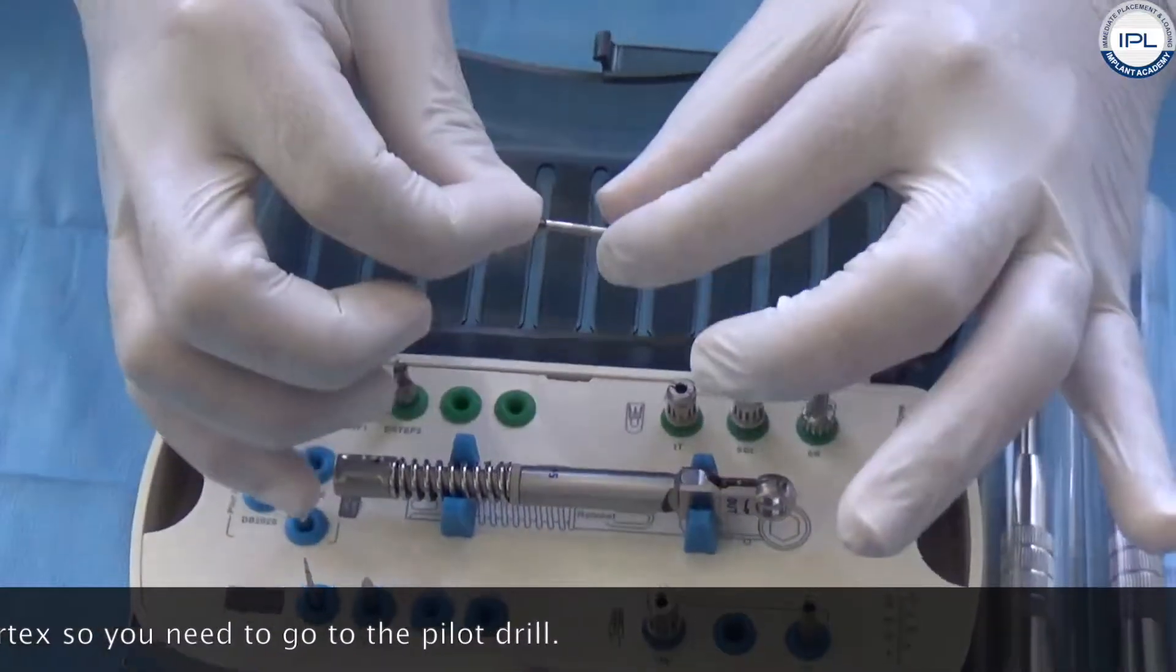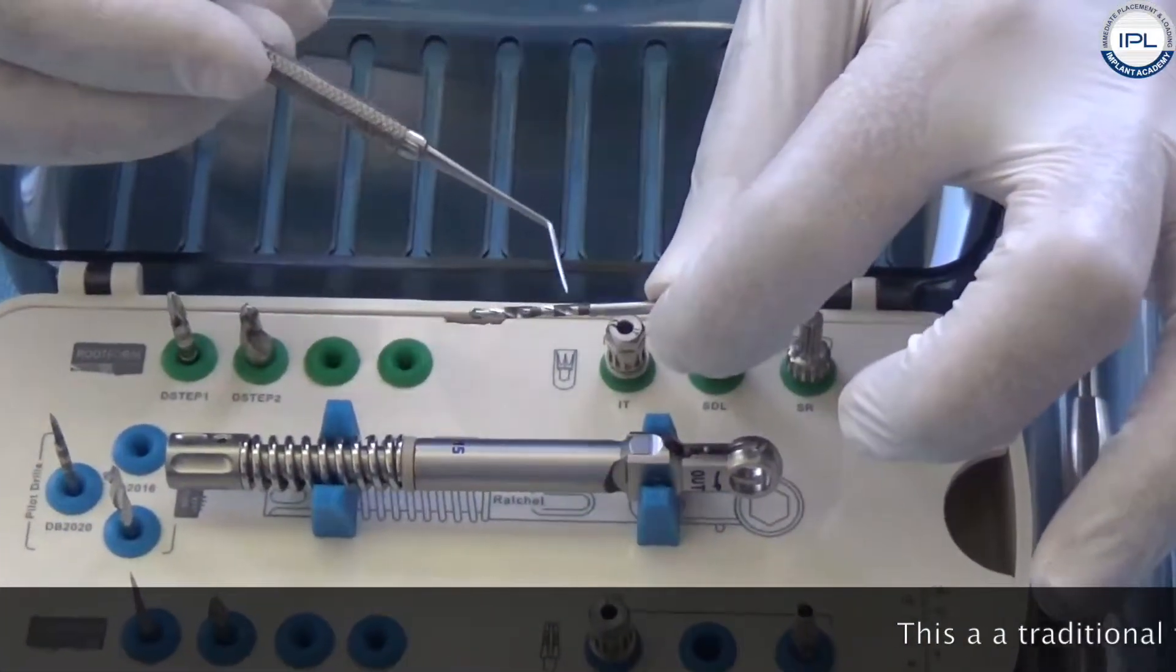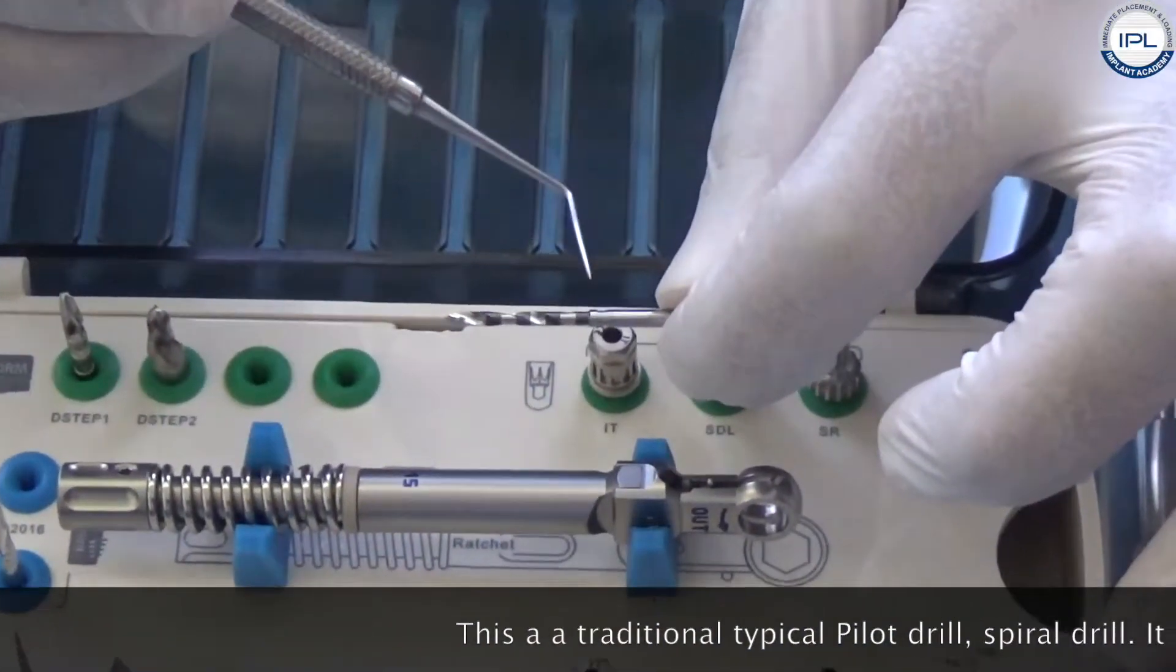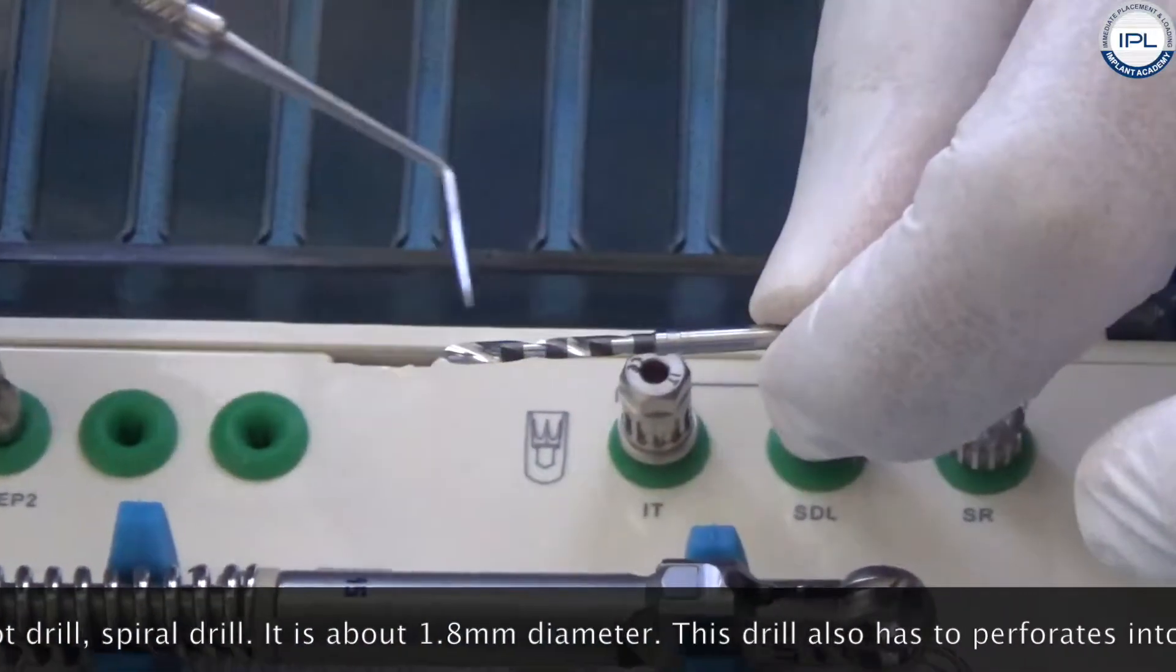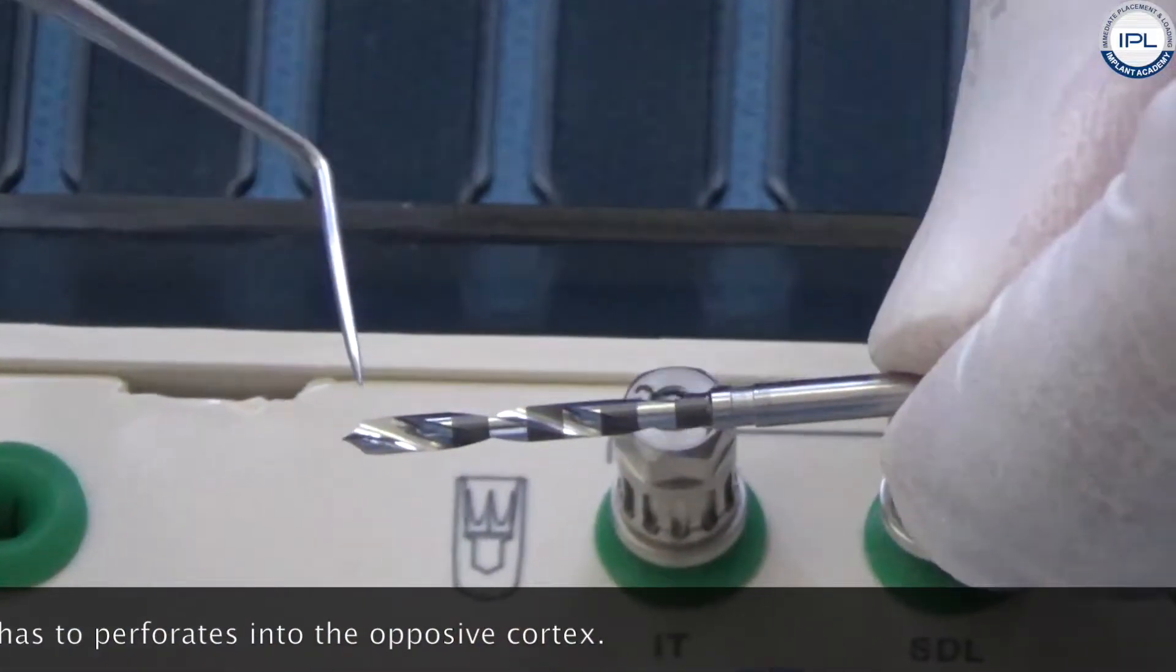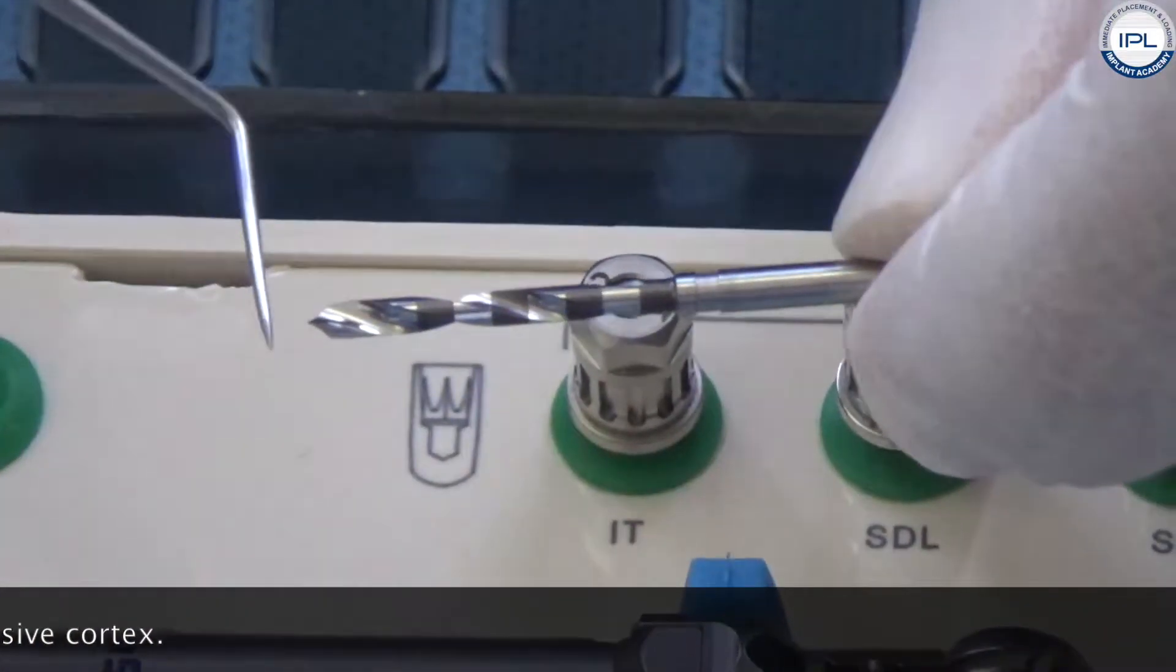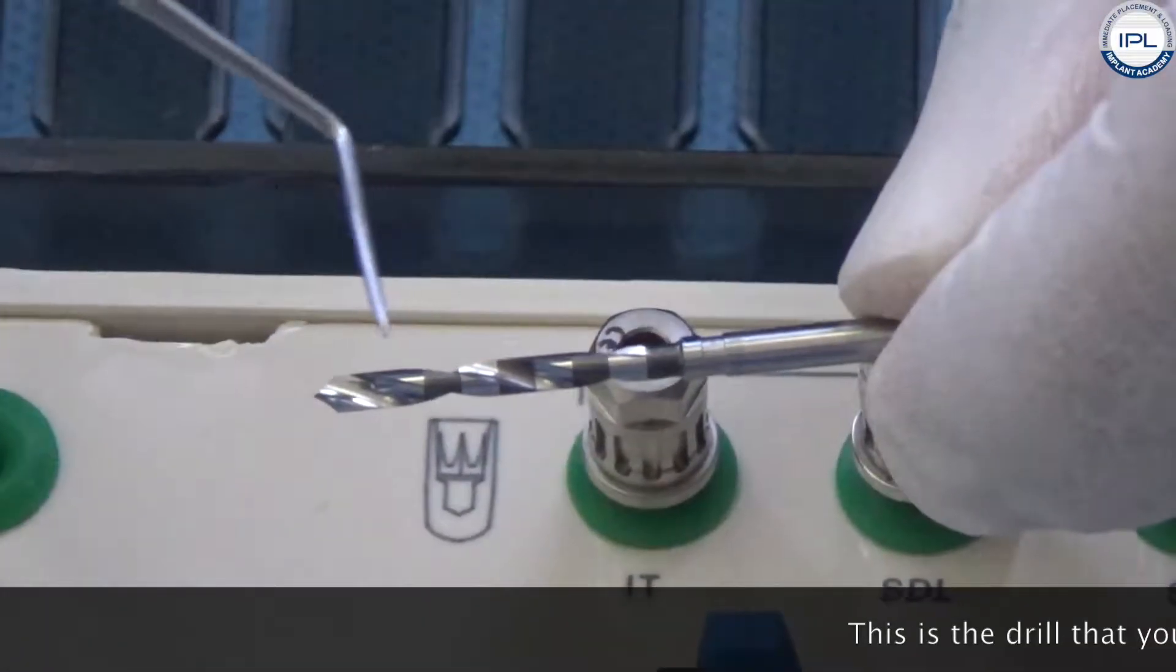So you need to go to your pilot drill. This is a traditional typical pilot drill spiral drill. It is about 1.8 millimeters in diameter and this drill also has to perforate into the opposing cortex. Only then your basal implant will go and engage into the opposing cortex. So this is the drill that we do for basal.